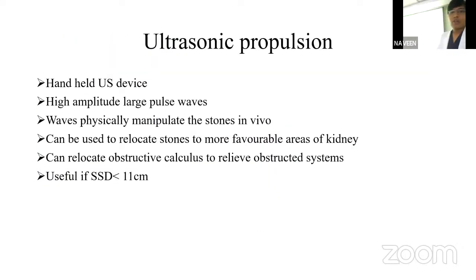Now come to a newer technology, ultrasonic propulsion. It is a handheld ultrasonic device. It can be used to relocate the stone to more favorable areas of the kidney, and can relocate the obstructing calculus and relieve the obstructed system.